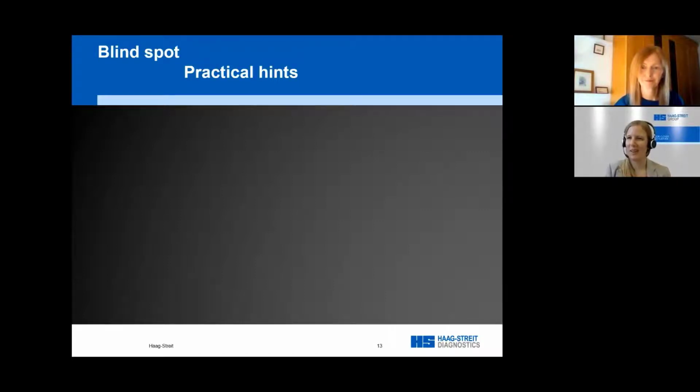I mean, it's quite a small area to test, yeah. Right? It is. So the interaction with the patient, as I've mentioned before, is really important. I treat blind spot testing the same way as if I'm looking to map a visual field defect area. So to do that, you need to choose a slow stimulus speed, and I typically choose 3 degrees per second, whereas for outer boundaries of the visual field, I will choose a faster strategy, usually 5 degrees per second.